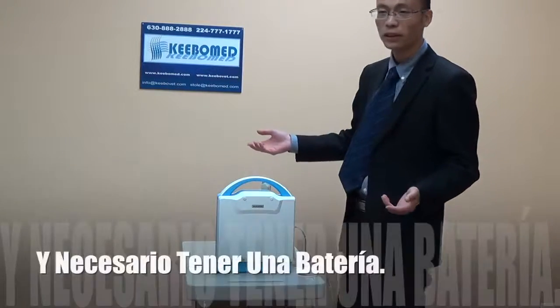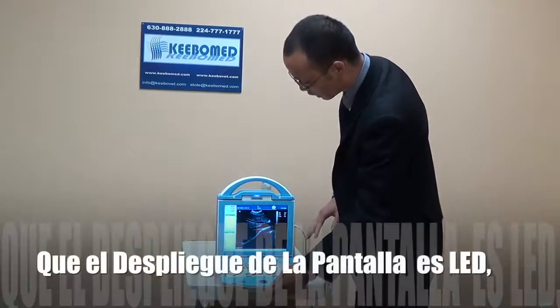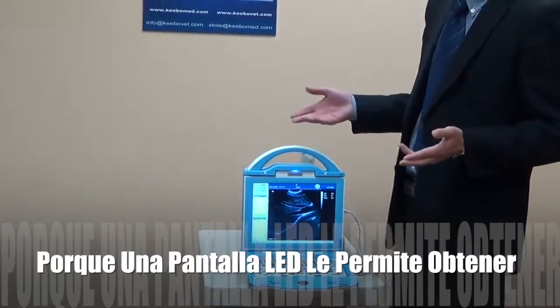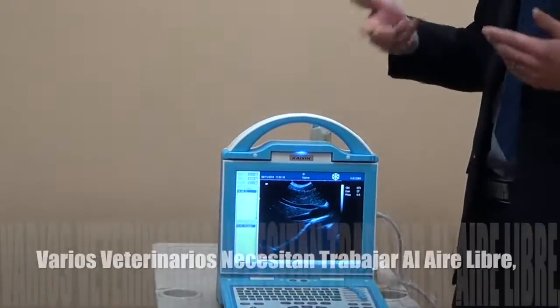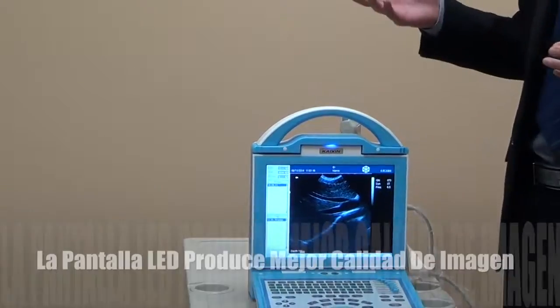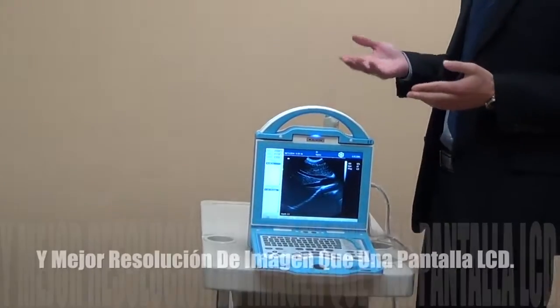For veterinary use, it is very convenient and very necessary to have a battery. Now let's open the unit. As you see, the display is LED, not LCD. LED means you can get a clear image when you work in sunshine — for veterinarians who sometimes need to work outdoors where sunshine makes it hard to see the image clearly. With an LED display, the image quality and resolution is much better than LCD.